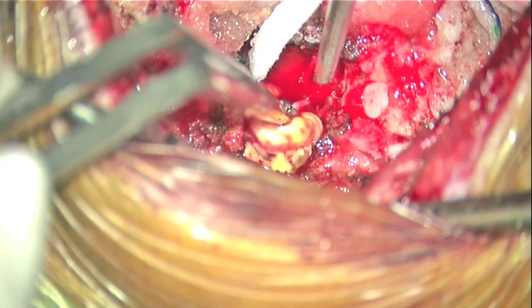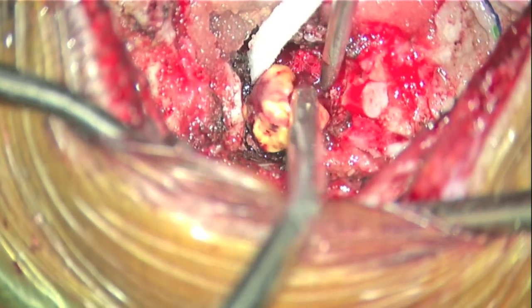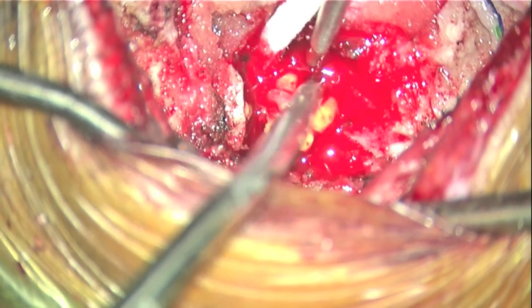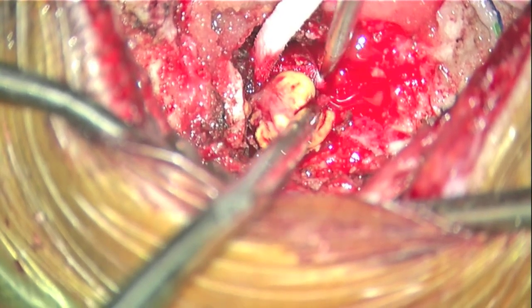Here, we did not adequately isolate and cauterize a paravertebral vein. The bleeding, as you can see, can be intimidating, but is usually managed with some suction, FlowSeal, or in this case, a small piece of gel foam and a little pressure on a cottonoid.